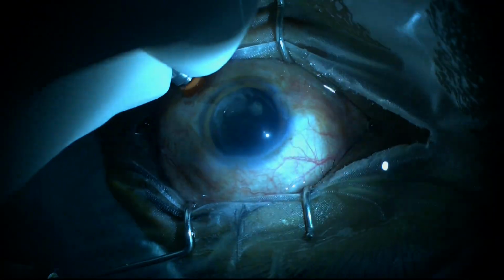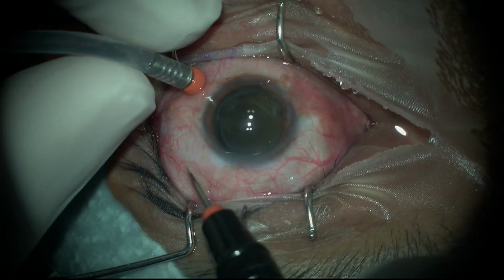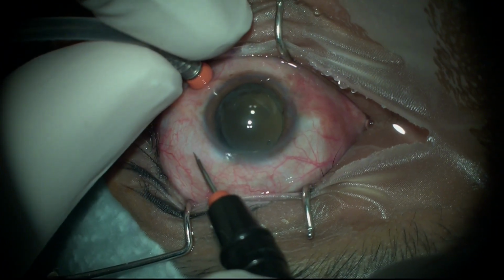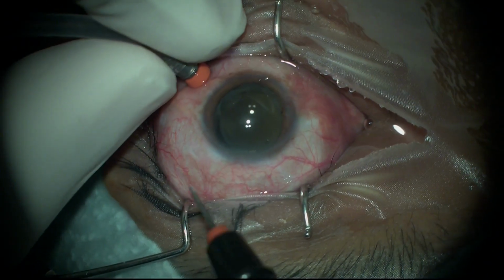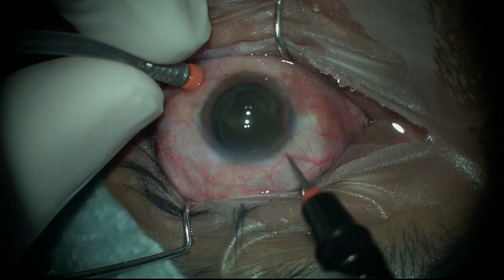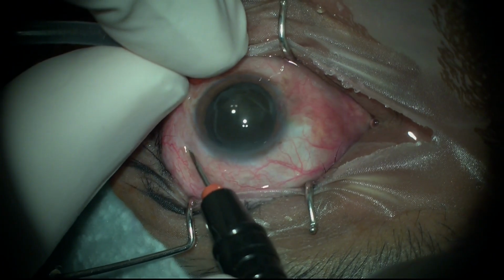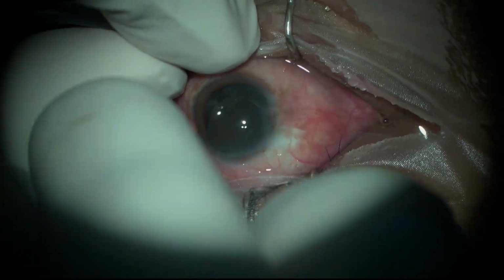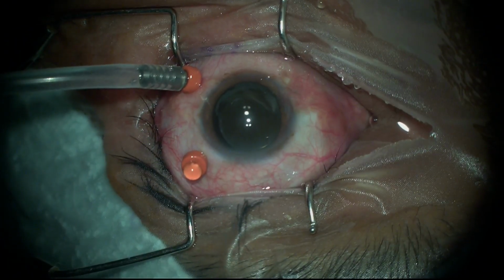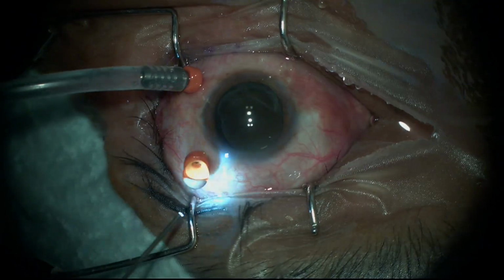So first thing which you do after putting your infusion line is you switch off the light and then you look for the visibility of the cannula in the correct vitreous space. And the visible sign which you depend on is there should be a metal cannula shining, and then you switch on the irrigation switch and your IOP will build up, and this is important for you to make a very nice sclerostomy which should seal by itself at the end of the surgery.